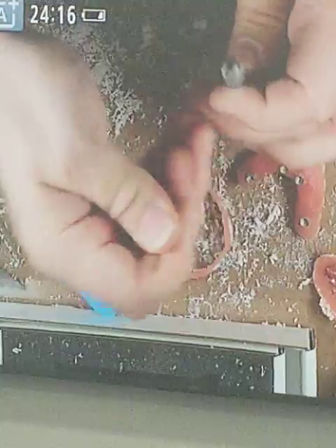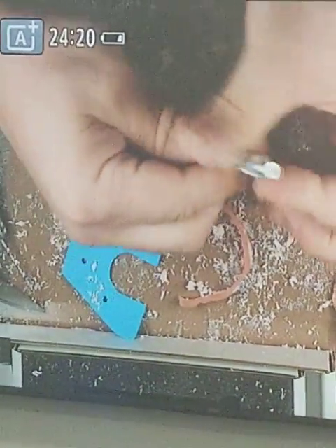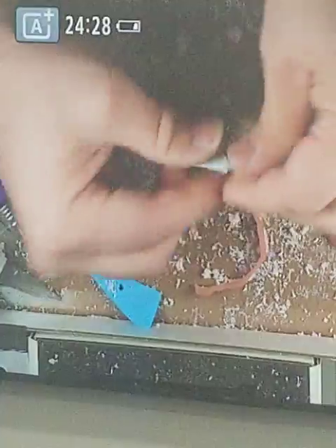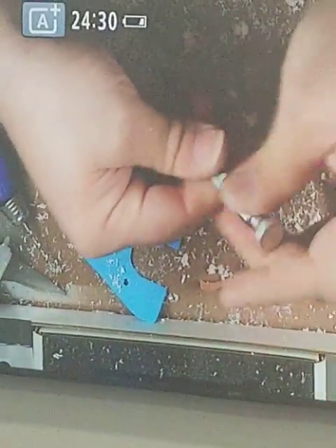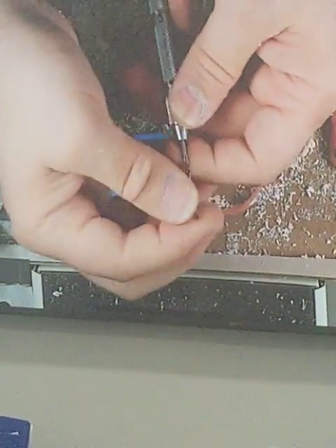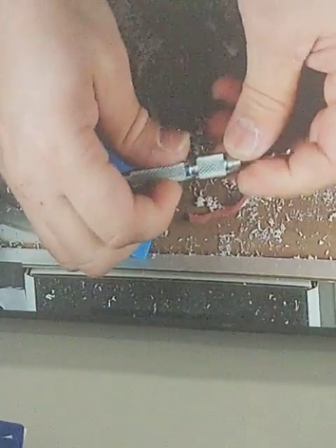And then after you've done that — these pin vices have a collet, and there's another one on the backside here. So you have four different diameter choices for what this can hold on to. I just made sure that I'm going to step on the collet that will hold this third drill. It's called the clearance drill, and I'm going to tighten that down by finger tightening.